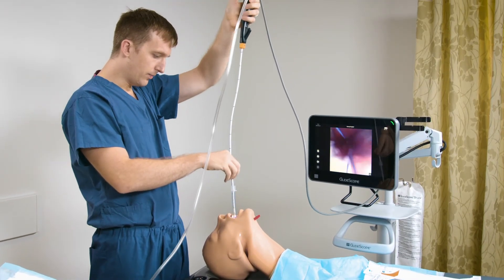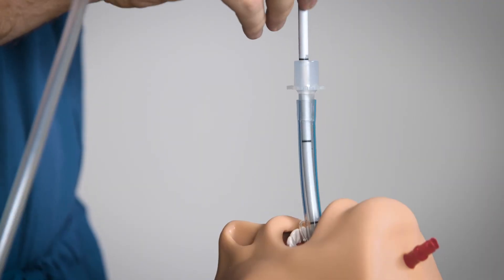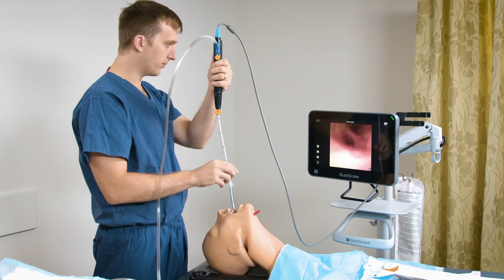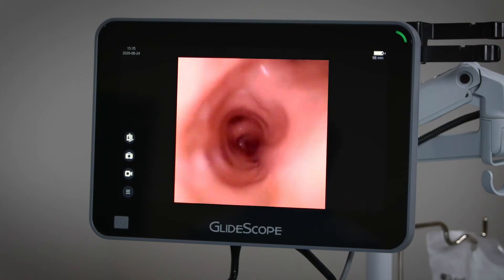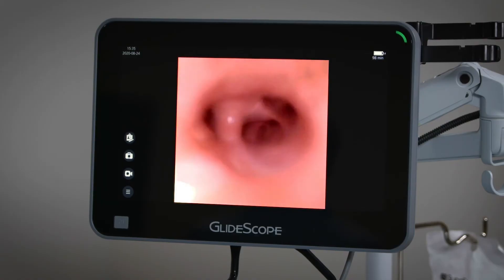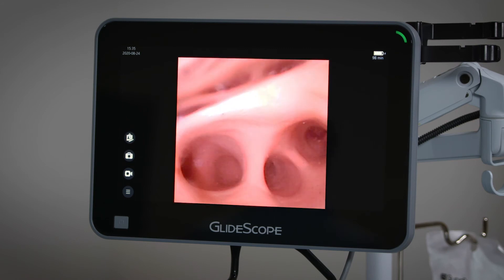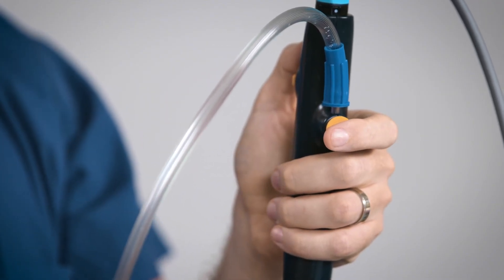As I insert the bronchoscope through the endotracheal tube, I make sure that I'm keeping the insertion tube straight to avoid kinking at the handle. I'm going to be performing suctioning in the patient's right lower lobe, making sure to keep my finger firmly over the suction button.